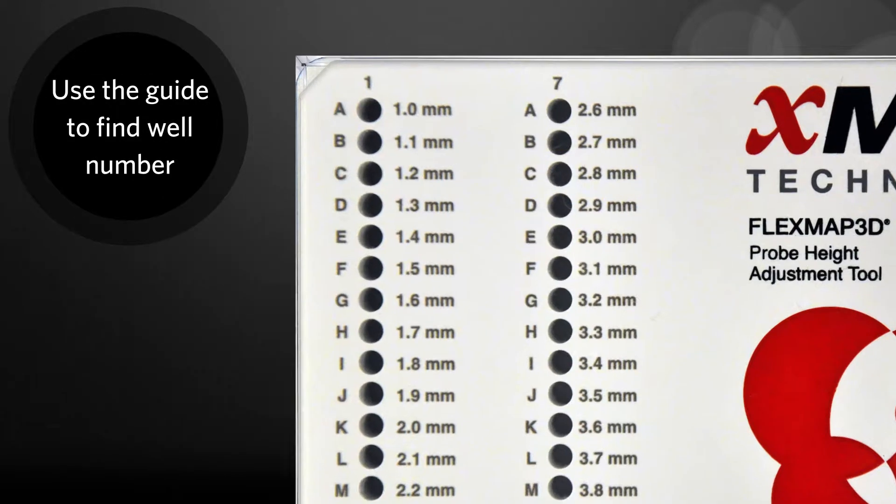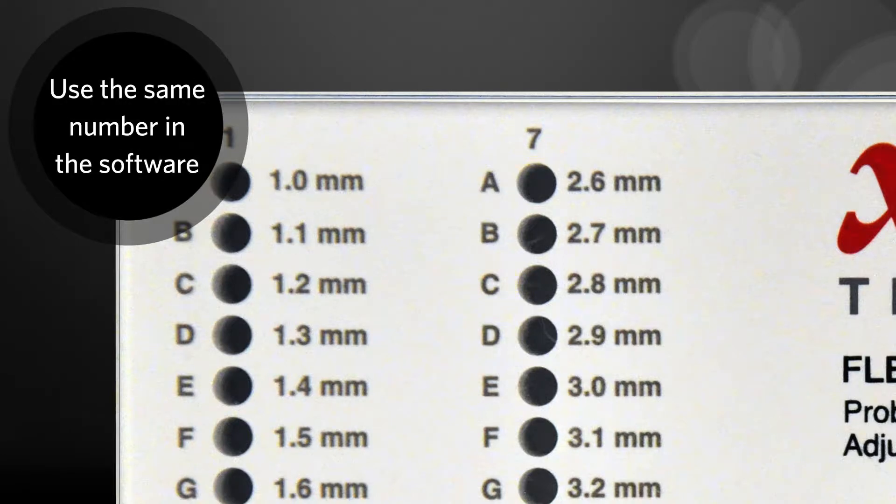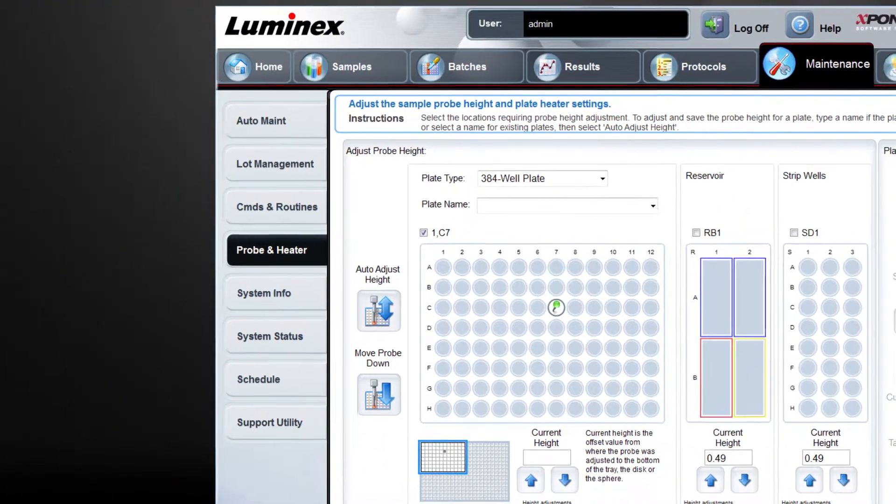Look at the guide on the probe height adjustment tool. For a difference of 2.8mm, as in this example, you select well C7. Once you determine the adjustment tool well to use, run the probe height adjustment procedure in the software.